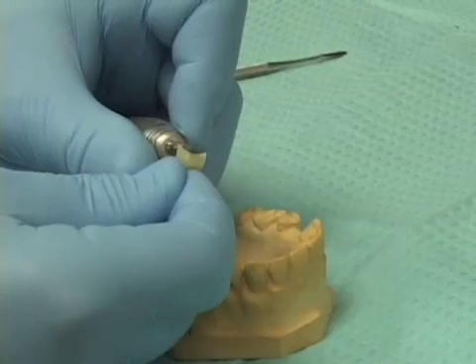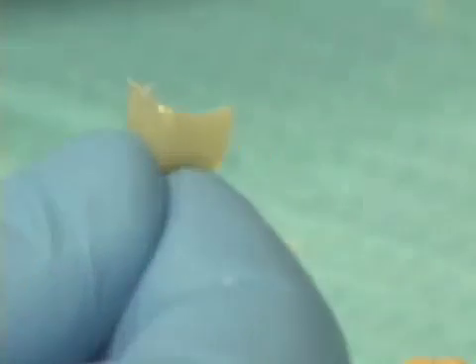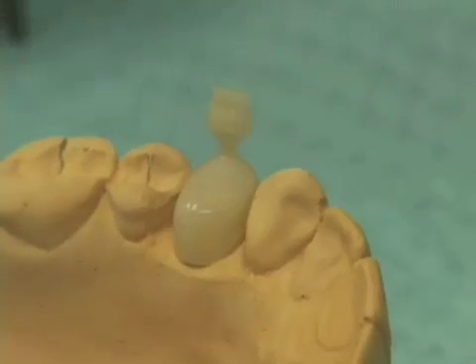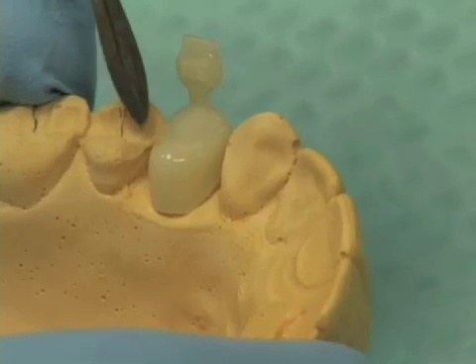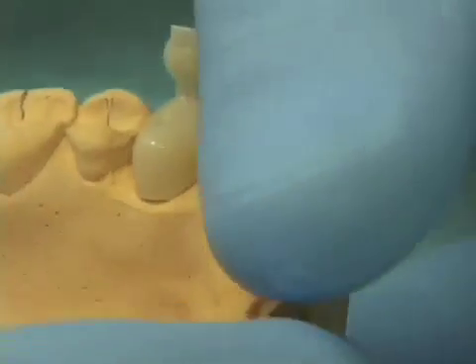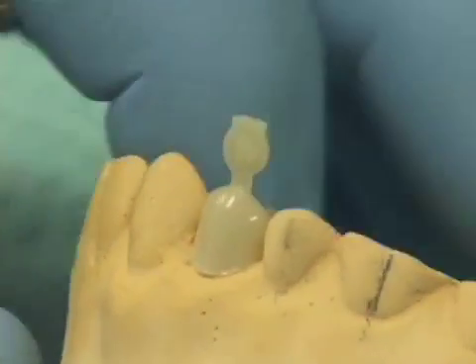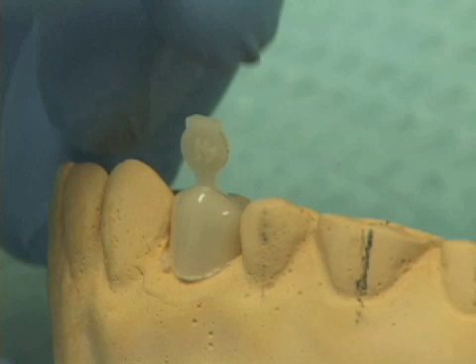If we choose one of the polycarbonate crown forms, what we want to do is take an acrylic burr and contour the cervical aspect of the polycarbonate crown form, shaping it by trial and error so that we're able to place that crown form on our cast and see that the marginal ridge area seems to be pretty even with the marginal ridge of the teeth on either side, and that the adaptation at the cervical aspect shows fairly good adaptation. Again, this can be done ahead of time before the patient ever comes to the appointment.